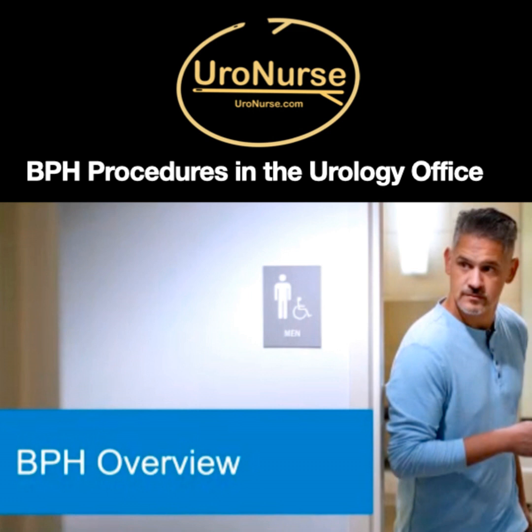All right, let's talk briefly about the Urolift. And like I said, it's a great procedure. If you've got a good grasp of it and you've done lots of them, you're going to have more success. It is a little more technically challenging. I started to run into more trouble with my larger glands. These patients would do fine for a year or two.